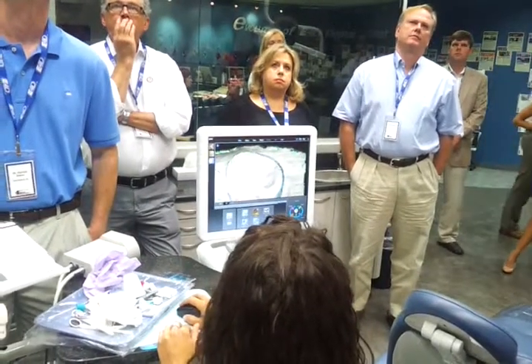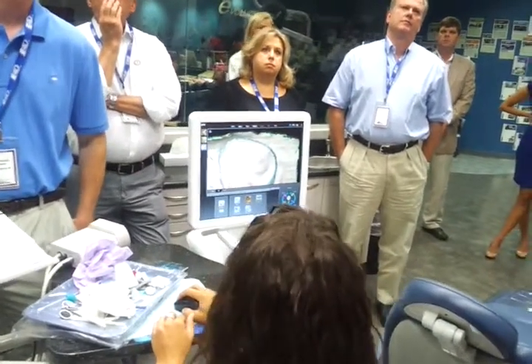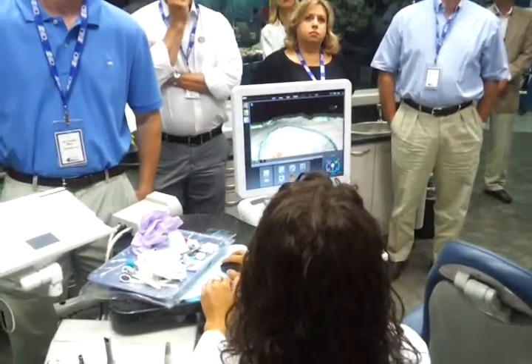Trace is used most frequently just because trace is the tool that you need to use when you have a subgingival margin. How many of you are doing 100% supragingival preparations? We can't really do that, can we, considering 80% of our dentistry is redentistry. So I'm just going to bump this out to the edge. We always are going to have to use trace a little bit.